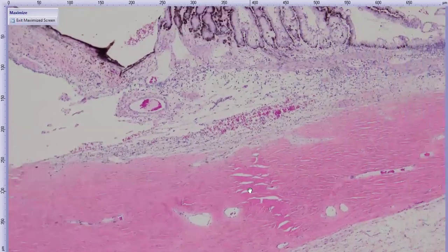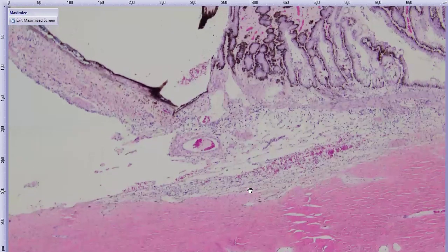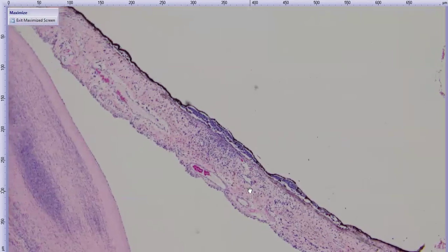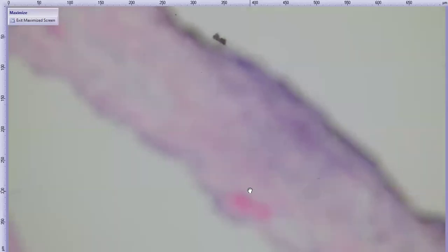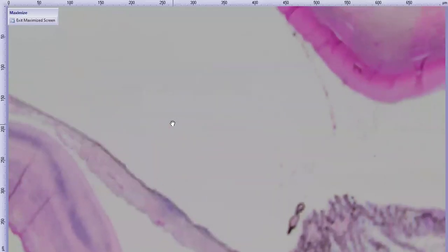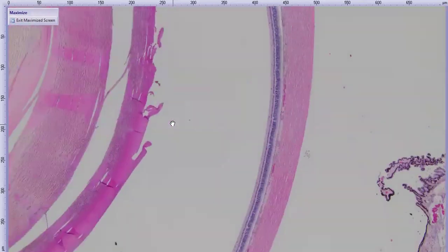As we head back, our angles, trabecular meshwork are pretty open, a little bit inflamed. Got a little bit of lymphoplasmacytic anterior uveitis. And a little preiridal fibrovascular membrane coursing along the front of the iris there. Kind of all probably secondary changes to the corneal ulceration.